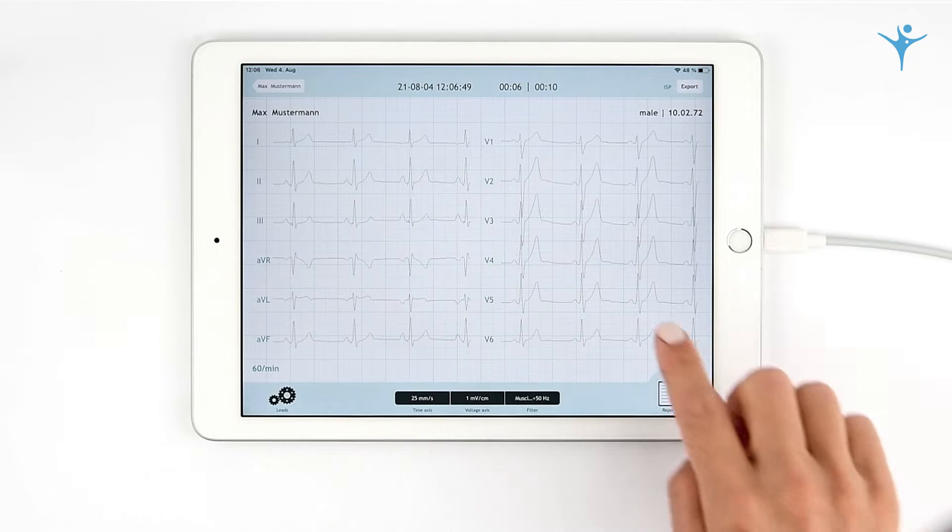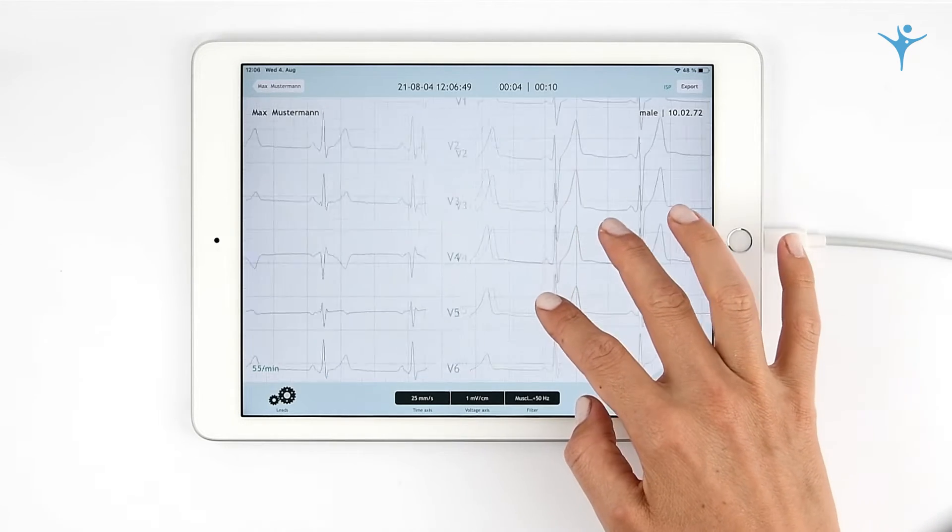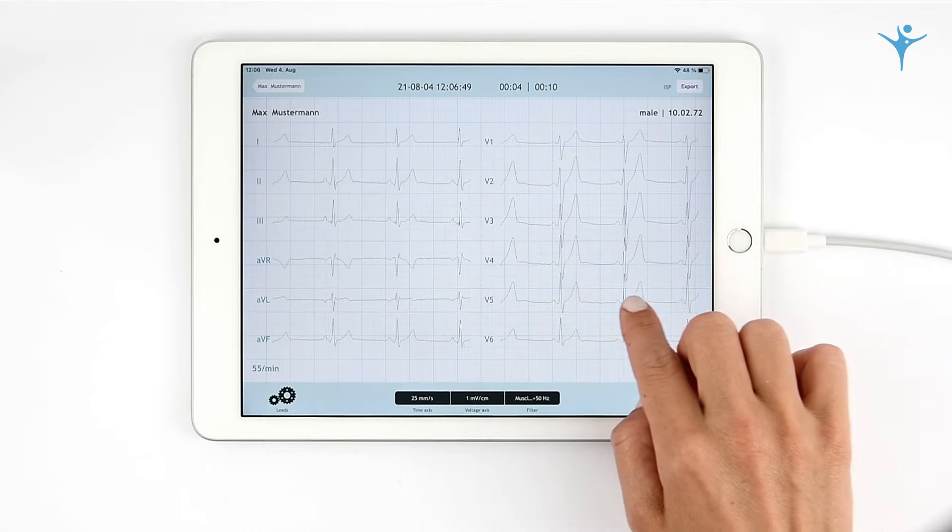After recording, you can move back and forth and zoom in on any segment. Here, you can generate your ECG report.